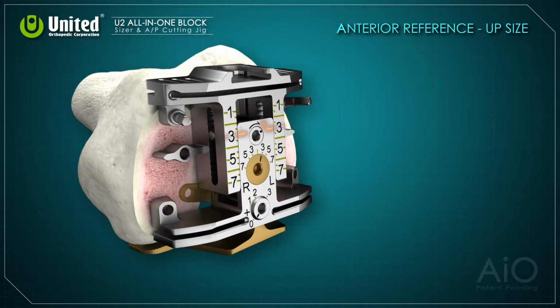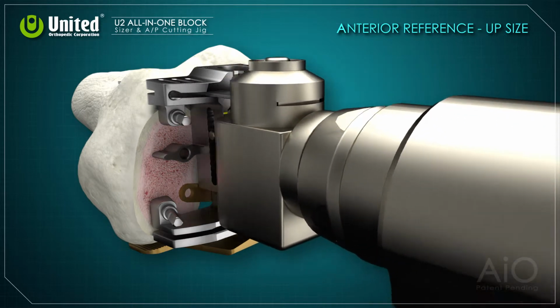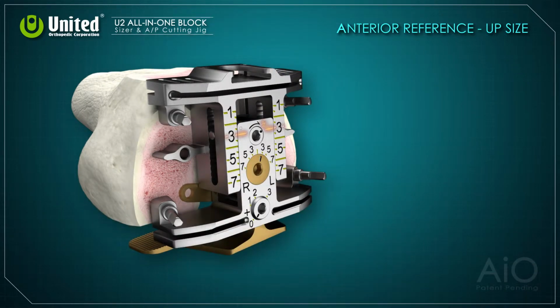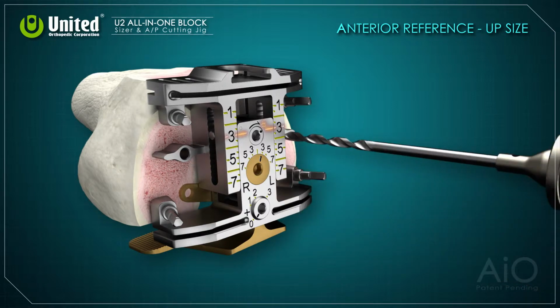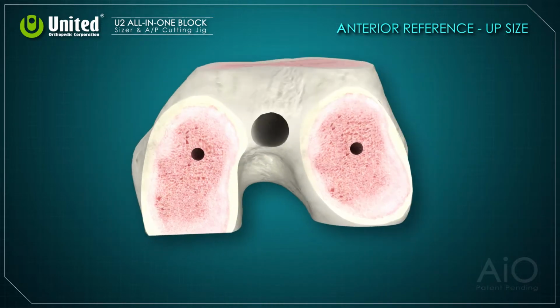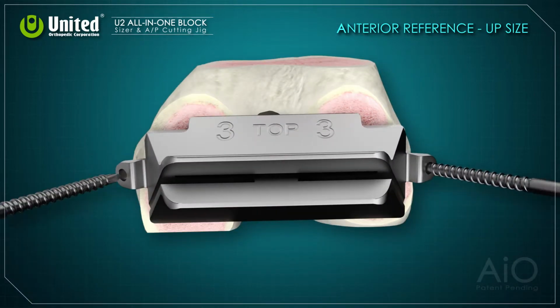Release the stylus. Fix the anterior and posterior slots before completing cuts by using a 1.27mm saw blade. Drill 2 reference holes to align the chamfer cutting jig. And perform chamfer cuts.